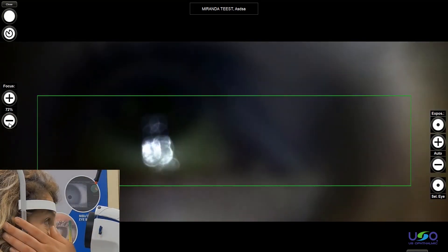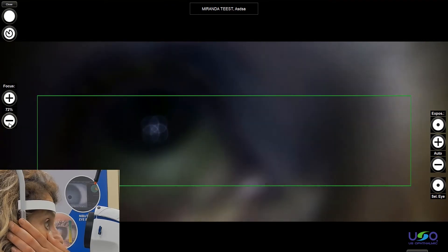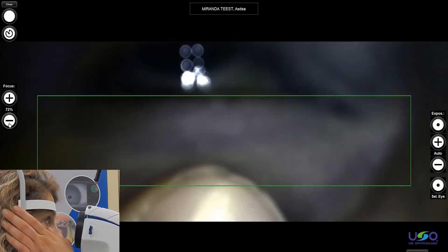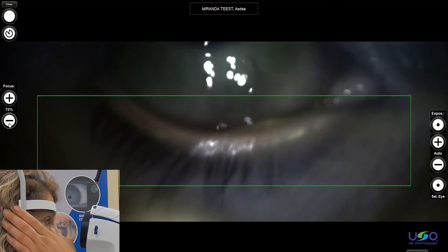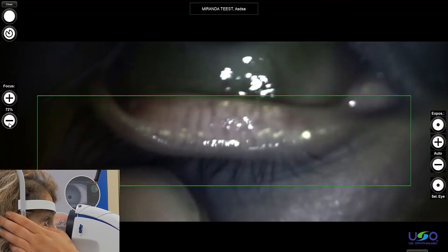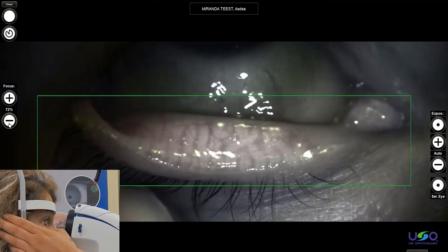Look up. Remember, the movement you should do is not pulling down. If you pull down, you are hiding the meibomian glands, and I hope you can see that in the picture. Just move a bit up so you can see. Looking at my screen: if I pull down, the lid is not averted. If instead you push, this is what happens — the lid comes out.